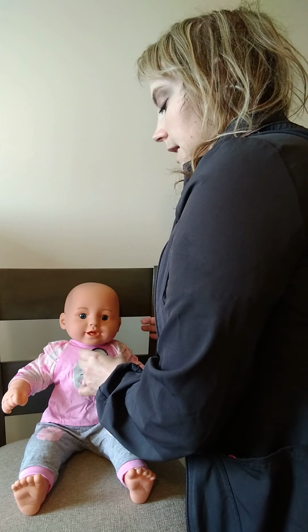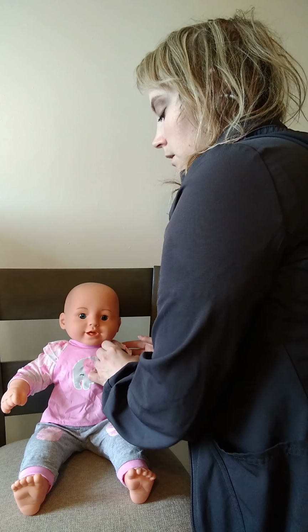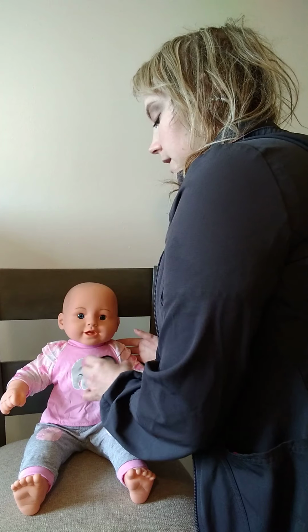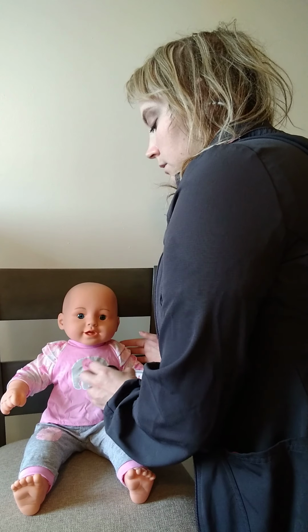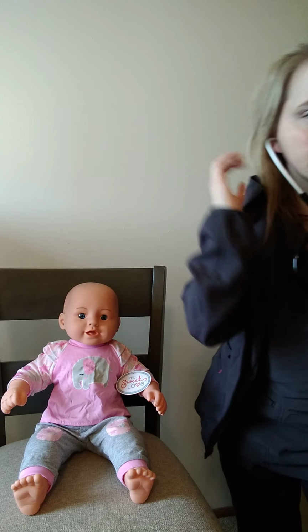Then I'm going to go down to the second intercostal space on both sides again and listen. Then the fourth intercostal space on both sides. I'm going to go a little bit lower on both sides. Okay, sounds normal.